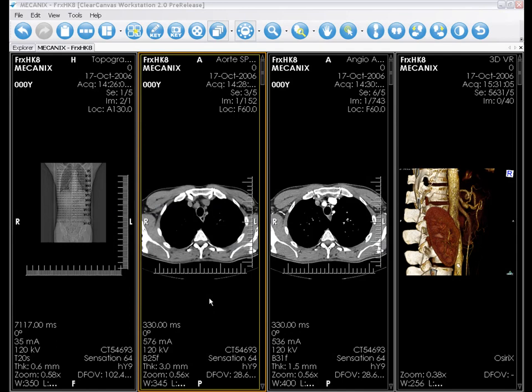Hi, my name is Jonathan and I'm a software developer at ClearCanvas. Today I'm going to introduce the multi-planar reconstruction feature of the ClearCanvas workstation.